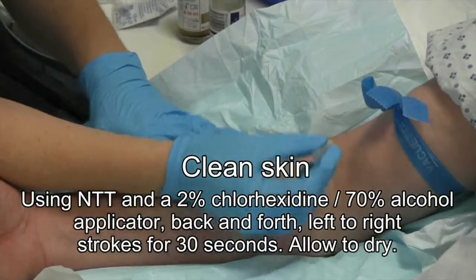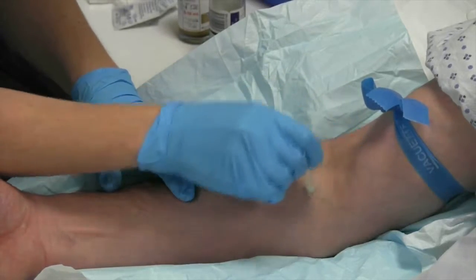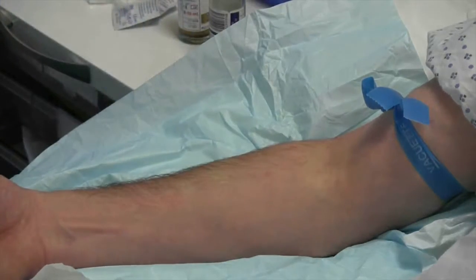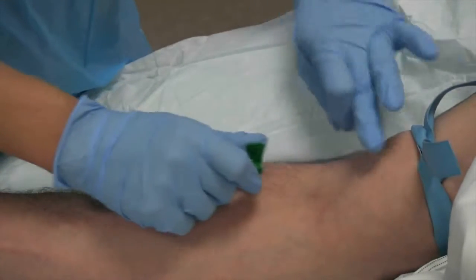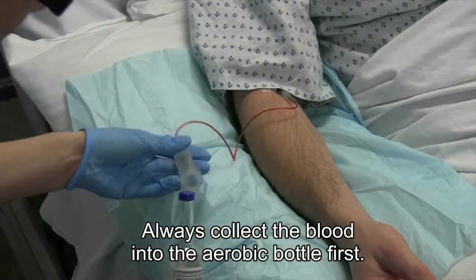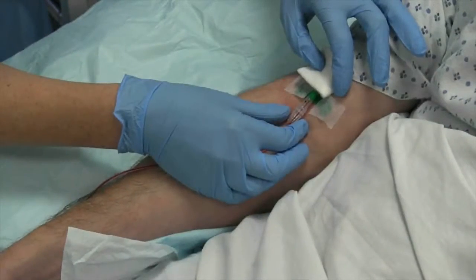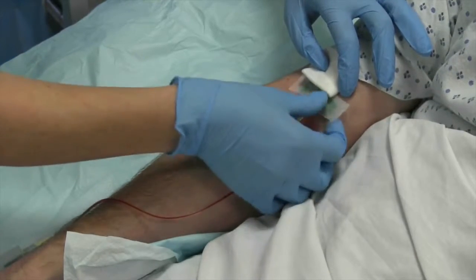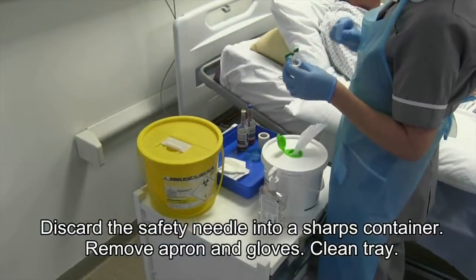Clean the skin as shown. Inoculate the aerobic bottle first. Activate the safety device as shown. Discard the safety needle into a sharps container.